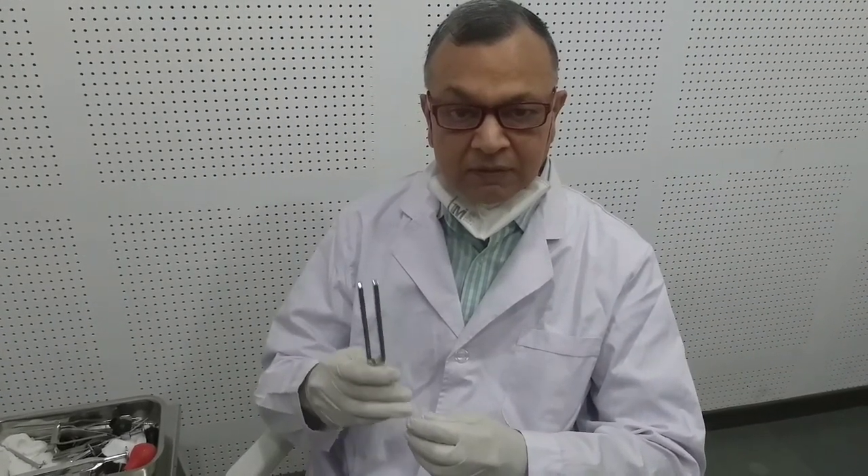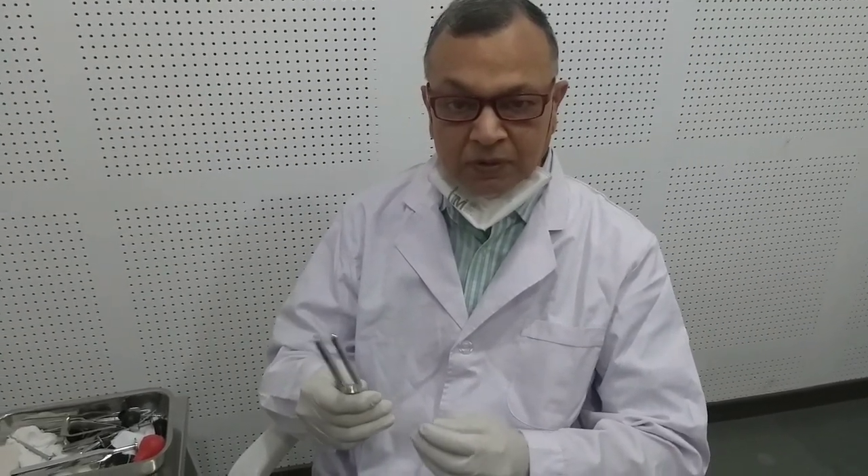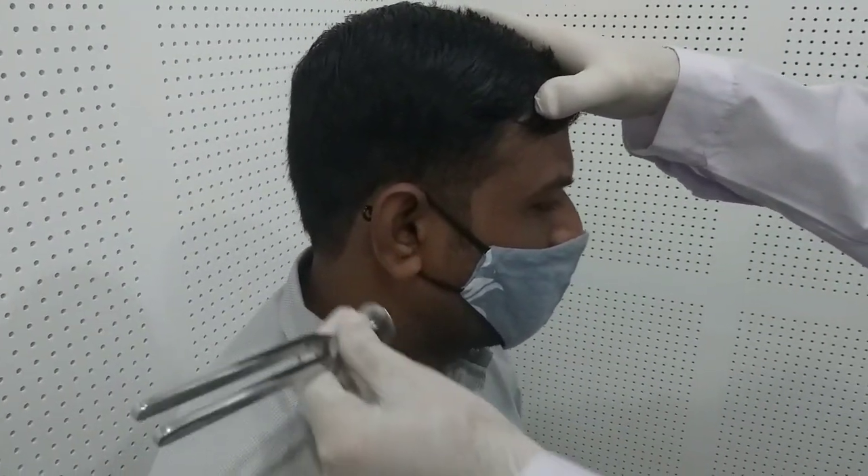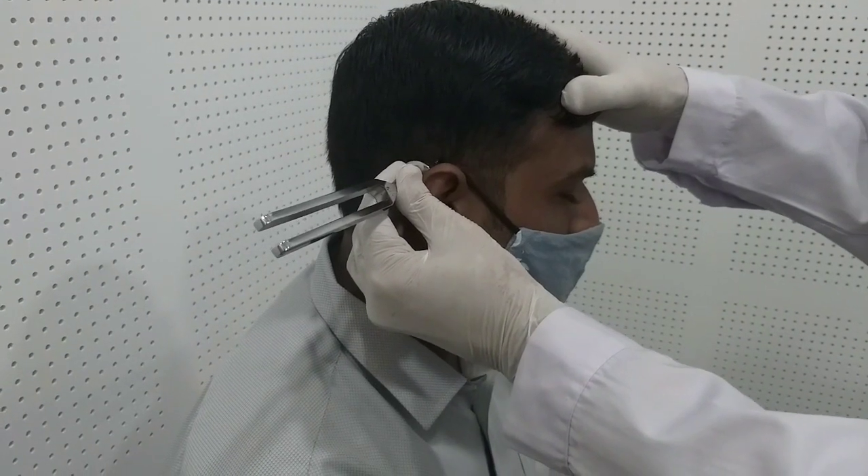For testing the air conduction, we put the charged tuning fork just near the external auditory canal. Then we put the same tuning fork on the mastoid bone. [To patient] Can you hear this? — Yes. Can you hear this? — Yes. Which is better, first or second? — First is better. So in this case, air conduction is better than bone conduction, which means the patient has Rinne's positive — either normal hearing or mild to moderate sensorineural hearing loss.